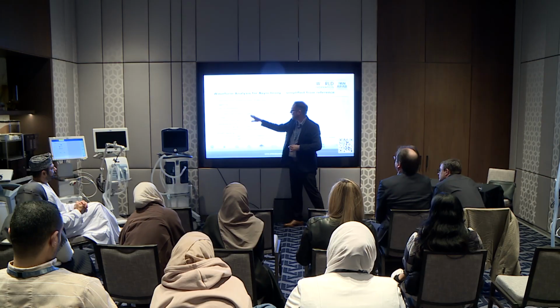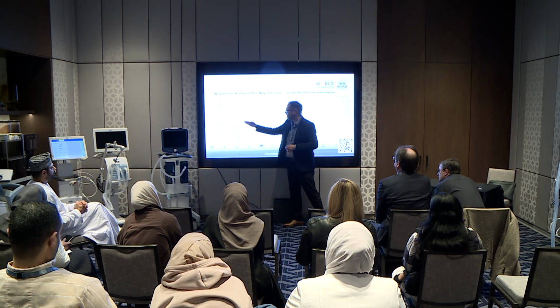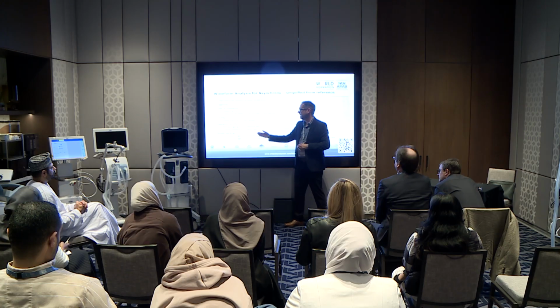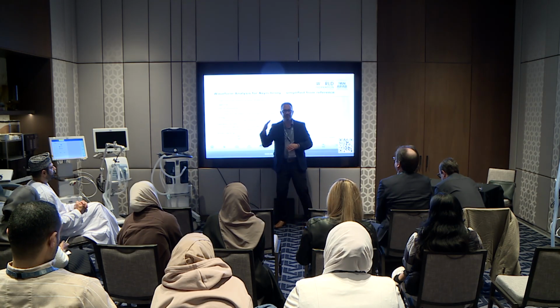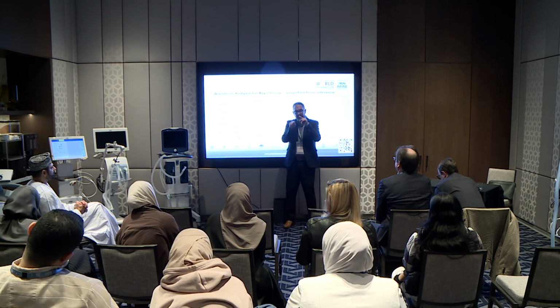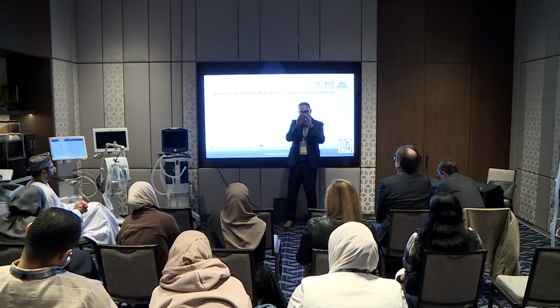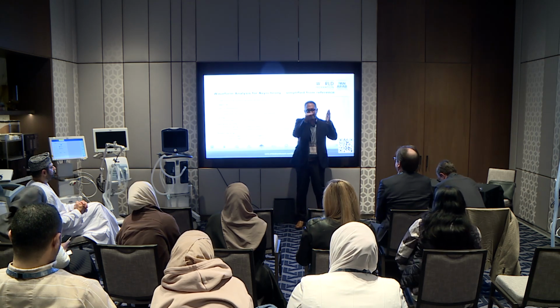You're going to decide whether or not it looks like the patient is under-assisted or over-assisted. Pay attention to the cycling. Look for any expiratory activity. So if it's normal, it's a nice exponential decay when they exhale. If there's ongoing PMUS, you see a blunting of the peak flow and there's like that blip right away. Ineffective effort, it's usually in between the two breaths you see a blip.